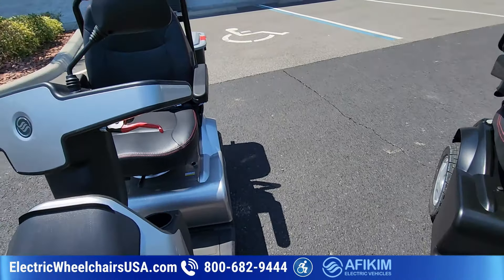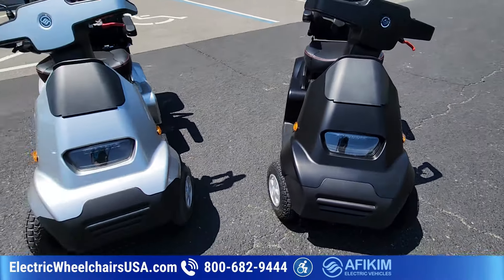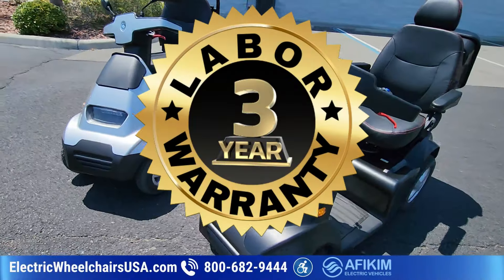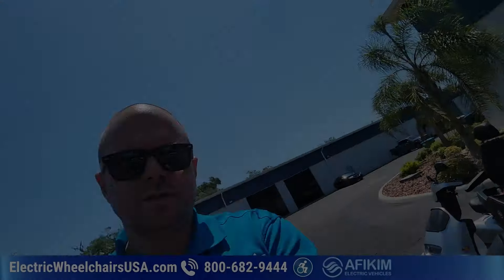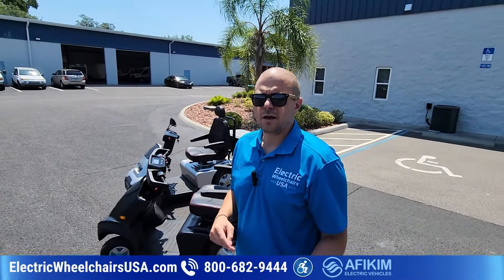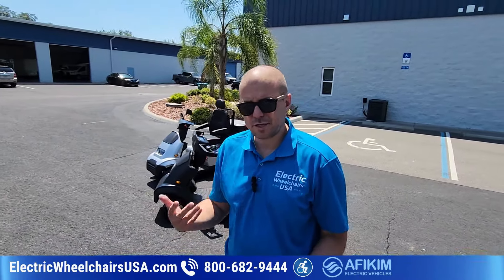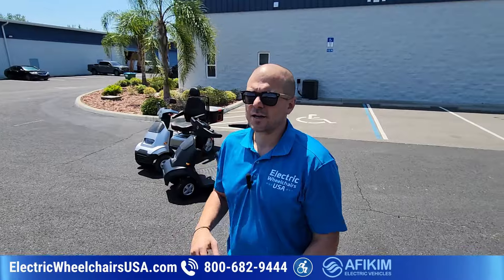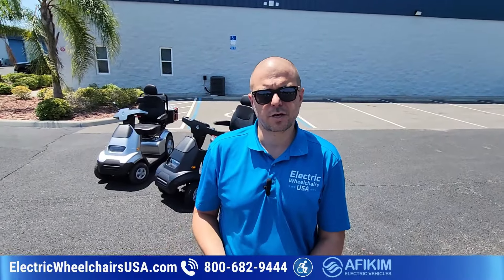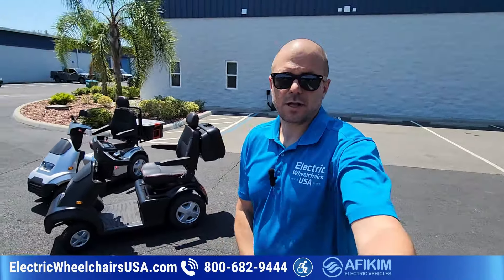One of my favorite things about these Afkim scooters is the warranty and support, in addition to them being such top quality — it's just a great brand. They do come with a three-year labor agreement, which is exclusive to Electric Wheelchairs USA. So if there are any issues in the first three years, they'll first try to troubleshoot with you, but if they can't fix it, they'll send a technician to your home. No other brand offers anything like that. A few brands offer a one-year labor contract, but Afkim offers three for added peace of mind.